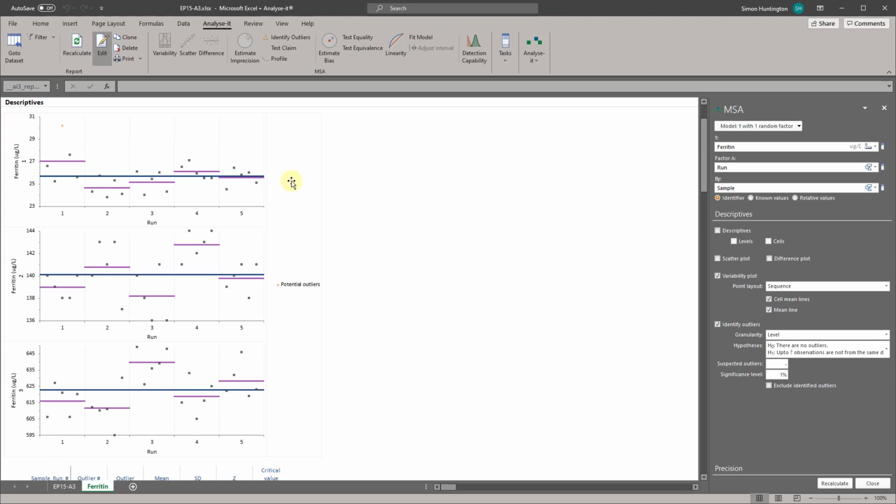The Variability Plot shows a simple visual assessment of the closeness of agreement between the measured values. The spread of each individual point represents the variation within each run. The purple lines show the mean of each run, the spread representing the variation between runs. The blue line shows the overall grand mean. You should observe the scatter of the points to ensure there are no obvious problems. If a result appears spurious, then you should investigate and correct any mistakes.